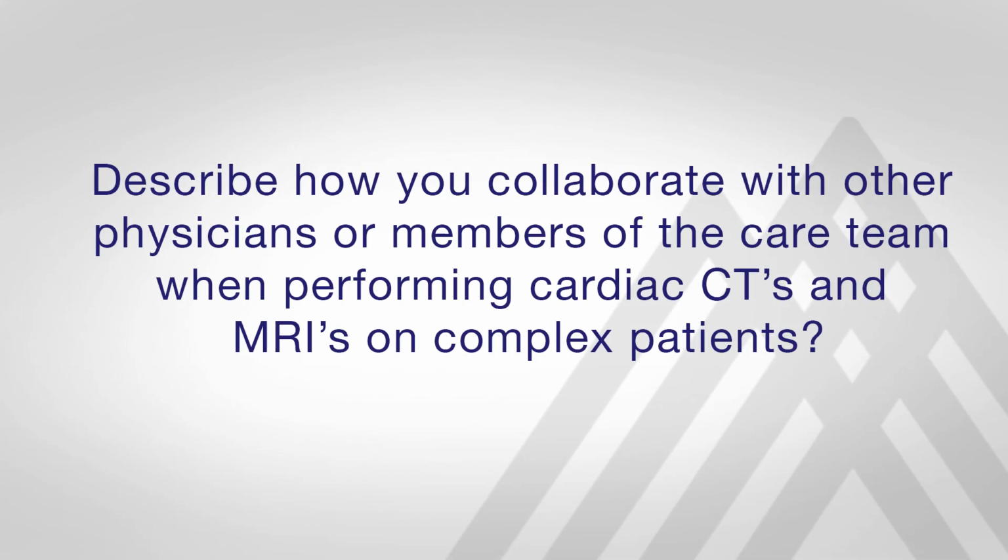We often use the pictures we get to make 3D reconstructions to help our surgeons and help our cardiac cath doctors perform the most successful procedure possible. So we work really closely with our referring doctors to understand the clinical question that the MRI or CT is asking. And then with cardiac CTs in pediatrics, we work really closely with our pediatric radiology colleagues to ensure we fully assess all the extra cardiac structures as well.